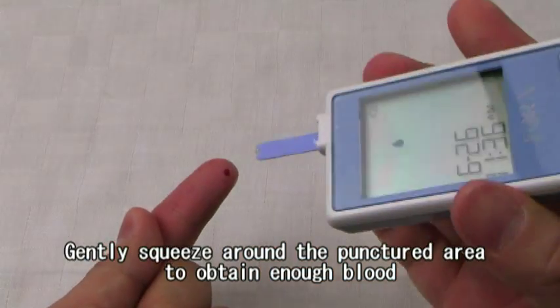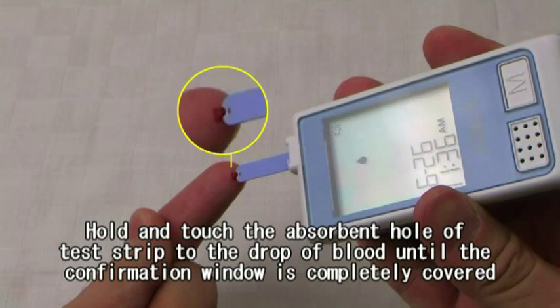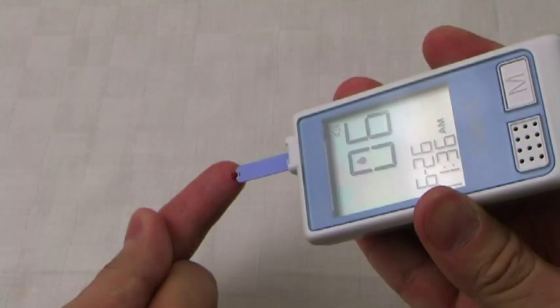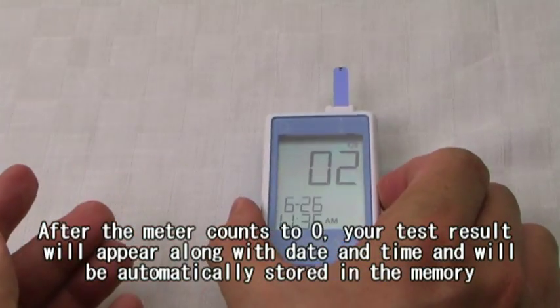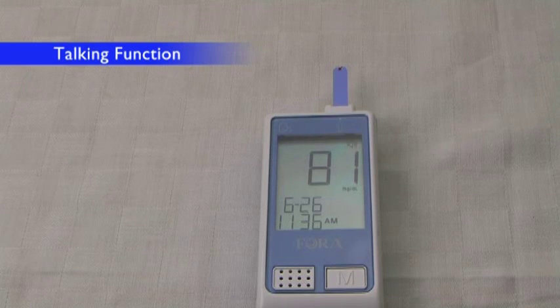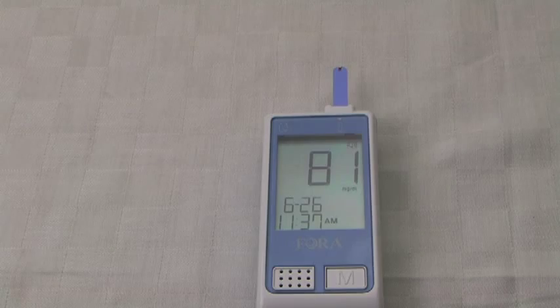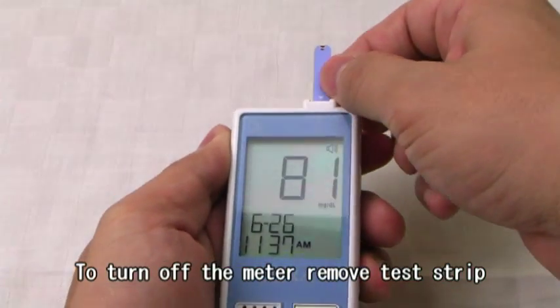Gently squeeze around the punctured area to obtain enough blood. Hold and touch the absorbent hole of the test strip to the drop of blood until the confirmation window is completely covered. After the meter counts to zero, your test result will appear along with date and time, and will be automatically stored in memory. The blood glucose is 81 mg per deciliter. To turn off the meter, remove the test strip.